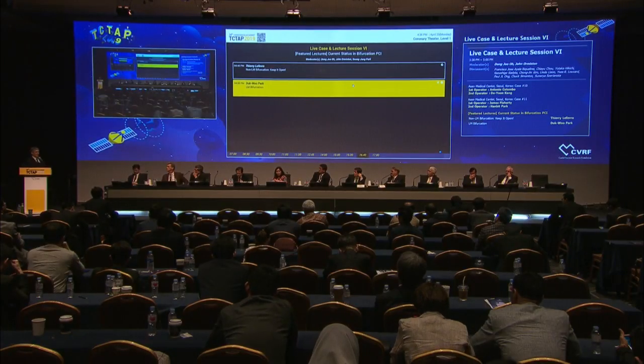Yeah. So, as you know, Gérard Finet was a promoter of this technique. We started to do some cases 3 years ago, and finally we decided to go back to our classical technique of POT and kiss, and sometimes final POT, because we saw by angiography that the carina, especially for the left main, was never where it should be at the end of the procedure. So finally, we decided to stop using this technique. And you have shown yesterday and today that it's not the optimal approach. So I fully agree with you.